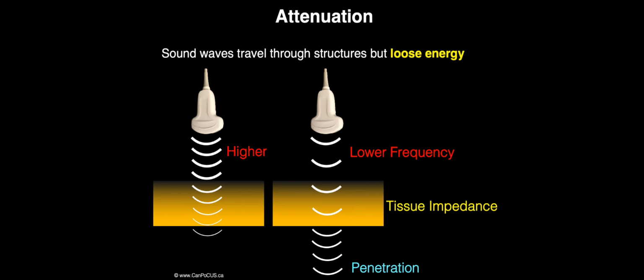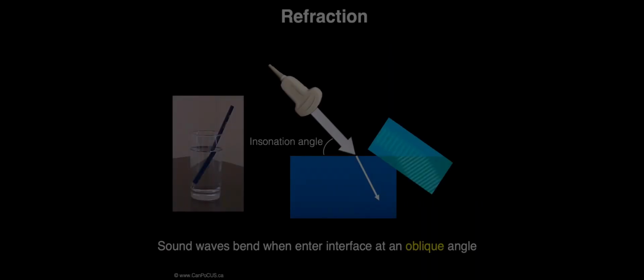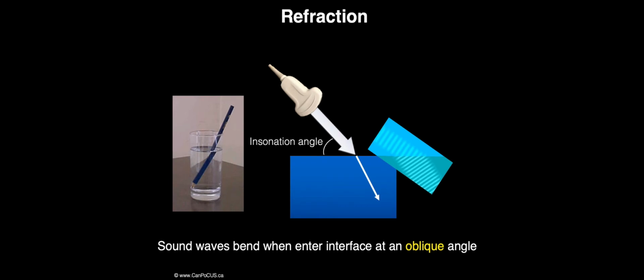This concept is frequently experienced in other examples of sound waves and also radio waves. Low-frequency bass music played by your neighbor is much more intrusive than high-frequency classical music, even if played at the same volume. Depending on the angle of insonation, sound waves can also be refracted as they pass through tissue.